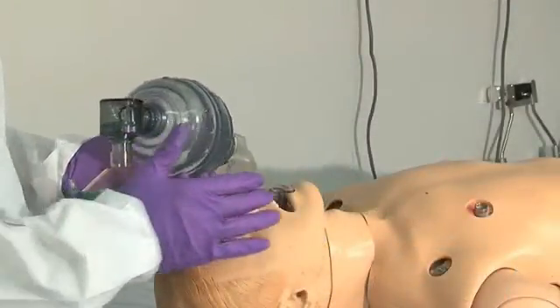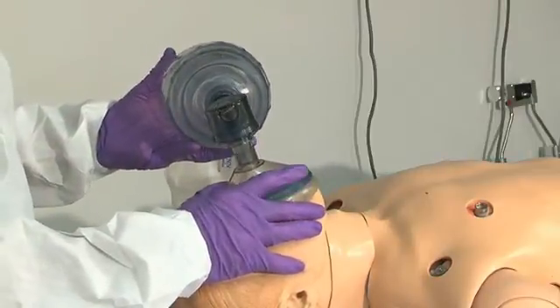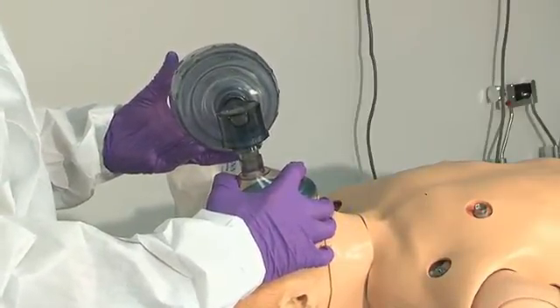In this patient I've already placed an oral pharyngeal airway. I make sure that my mask fits comfortably over the mouth and nose and then I get a good seal by grasping the mask and securing it by holding on to the mandible.